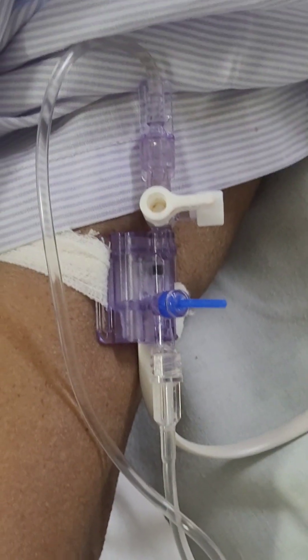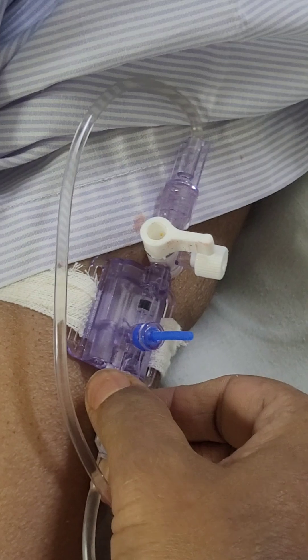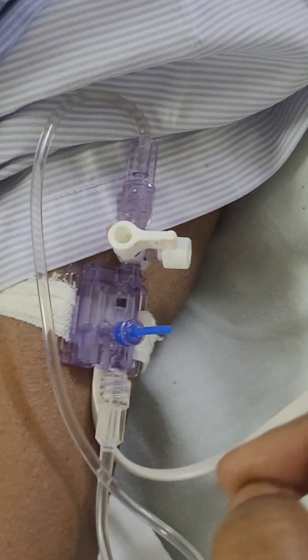Hello everyone, Dr. Josana here. I will be telling you about the arterial line transducer, what zeroing is, and how to do the zeroing — the bedside maneuver. I will be telling you about the transducer of the arterial line and how to do zeroing.